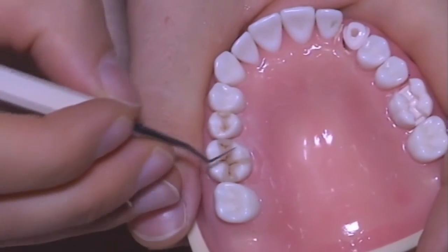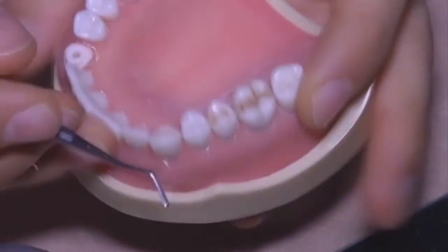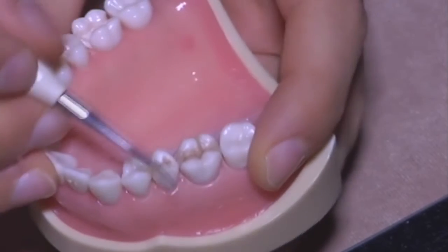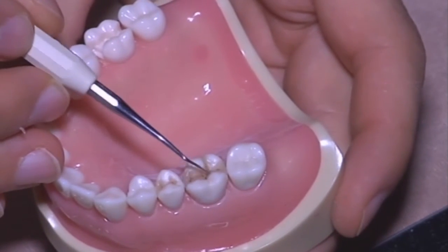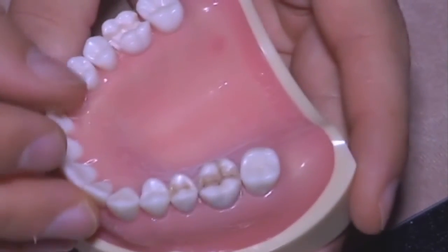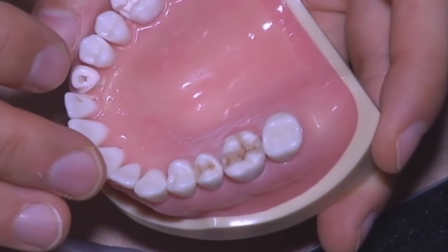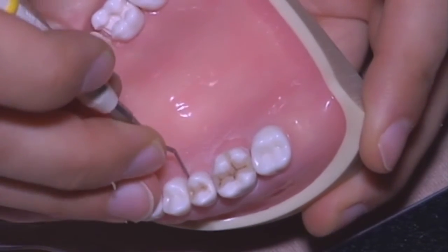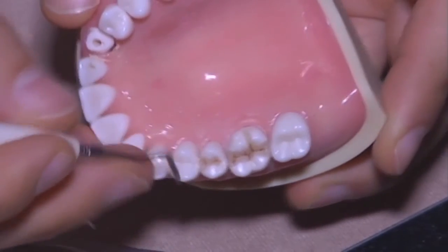So let's spend 5 minutes more in giving correct shape and correct angulation of every area of the posterior restoration, in order to have a restoration which is already done when you finish, in order to not need a lot of work once you remove the rubber dam and once you let the patient go away.